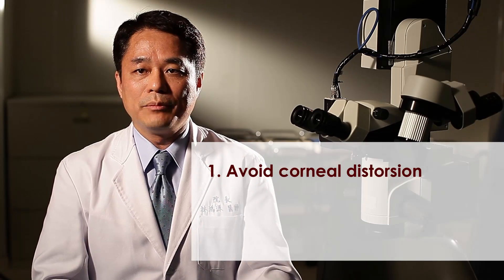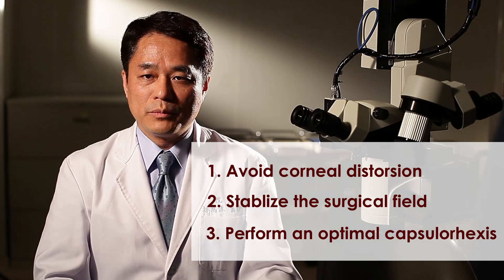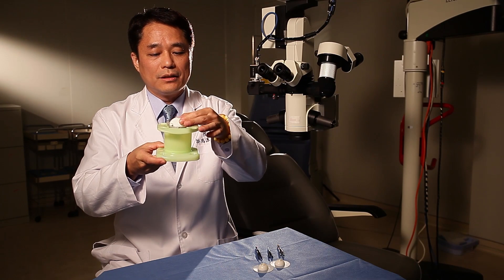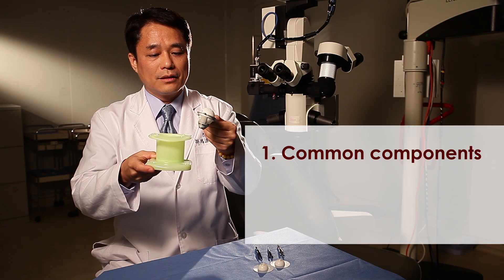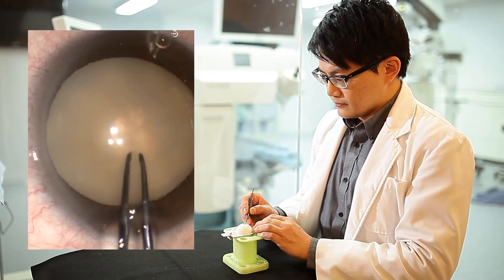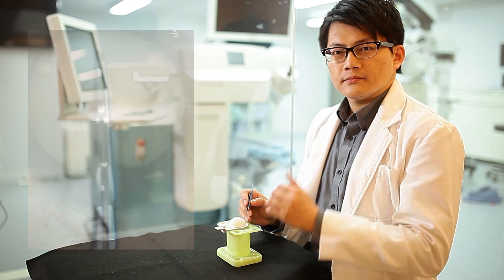The concept of invisible pivot is critical to microincision cataract surgery. It can avoid corneal distortion, stabilize the surgical field, and most importantly, achieve a well-centered, optimally sized, and round enough capsulorrhexis through a smaller incision. In this video, we provide a step-by-step assembly guide for a freely rotatable eye model. Its components are very common, its price is quite low, and you can definitely do it yourself. With the rotatable eye model and invisible pivot concept, you can practice anywhere. Capsulorrhexis in microincision cataract surgery won't be the rock in the road ever again.